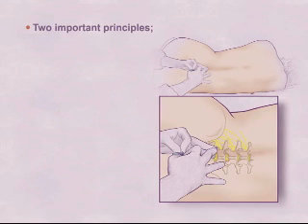A. Because the nerve roots are covered with dura, sharp and/or thin needles should not be used for this block. Even 22-gauge B-bevel needles should not be used due to the danger of dural penetration and subsequent large-volume subarachnoid injection. As a general principle, large-bore Tuohy needles, 16 to 18 gauge, should be the best choice here since these are the least likely to penetrate the dura.